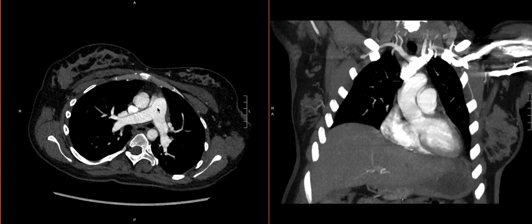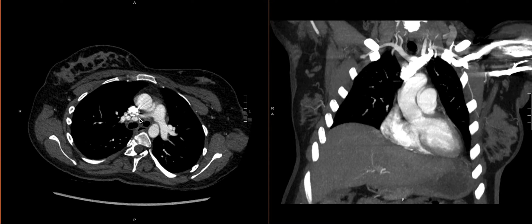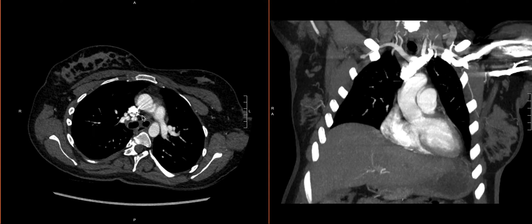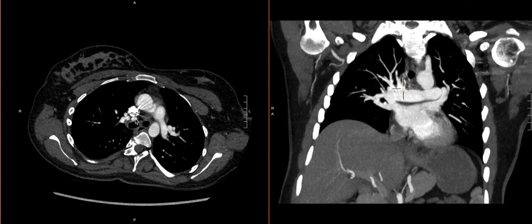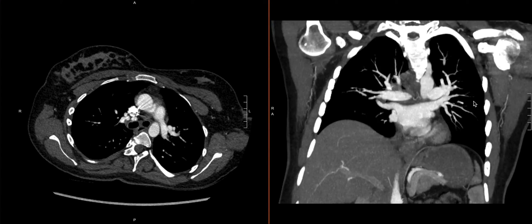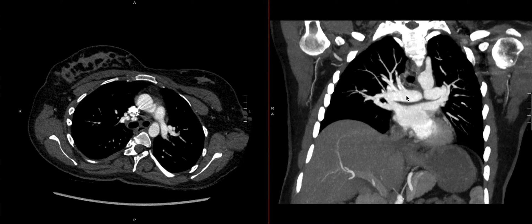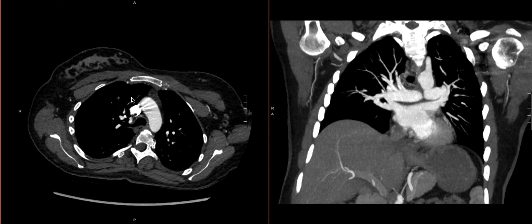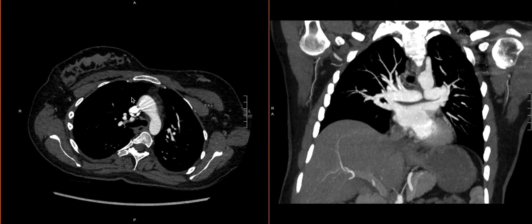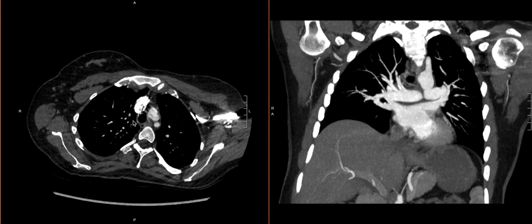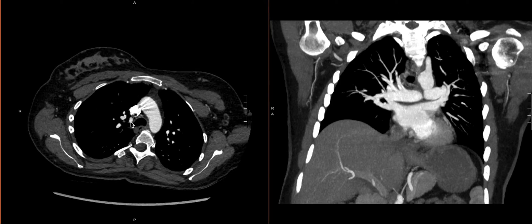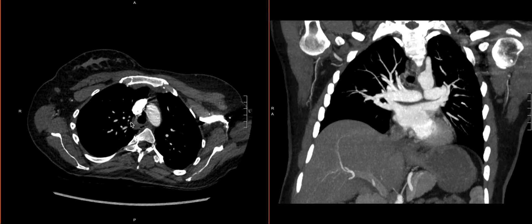So we start with the trunk and then you can go down the right side. Be aware that some of these vessels may branch earlier on. We can triangulate right here and see that we have some branching vessels coming off the right main pulmonary artery. It may not be entirely clear technically whether this is lobar or segmental — probably more segmental in this patient, who has other branches going up to the right upper lobe. The most important thing is to trace these branches out as far as you can, then trace them back, and then go very systematically to the other segmental branches going up to the right upper lobe, looking for those filling defects.